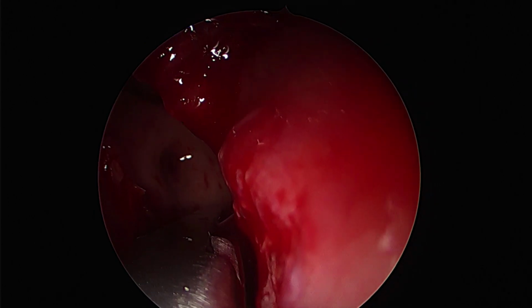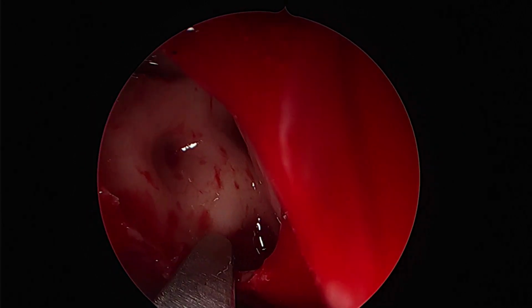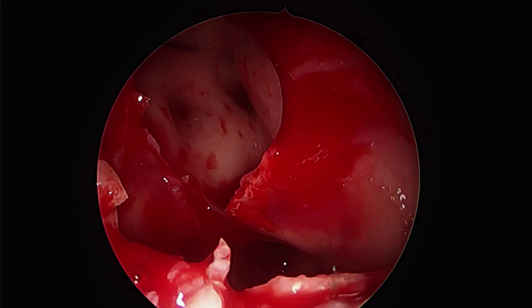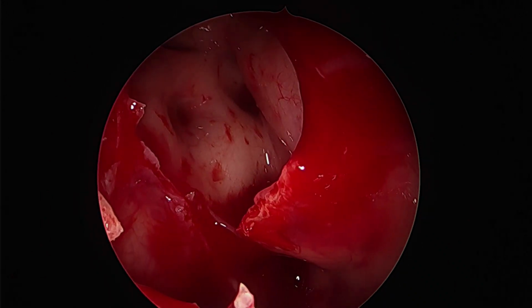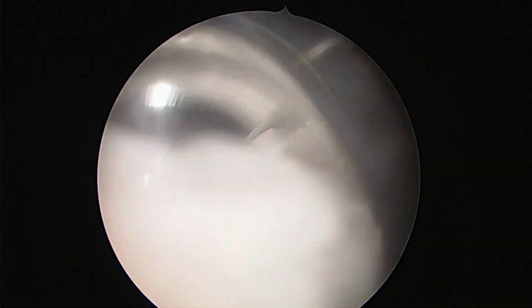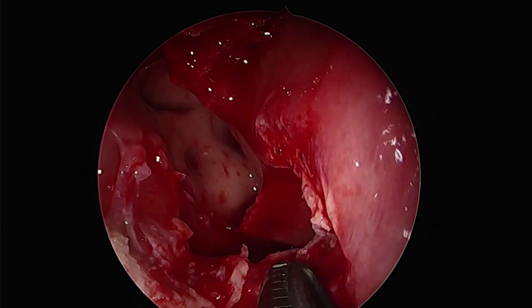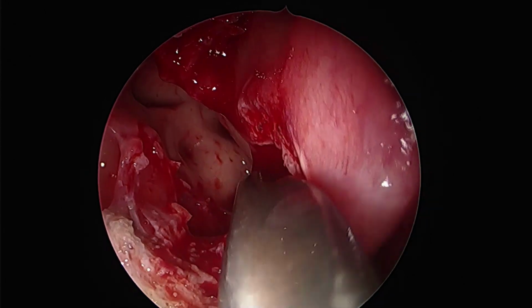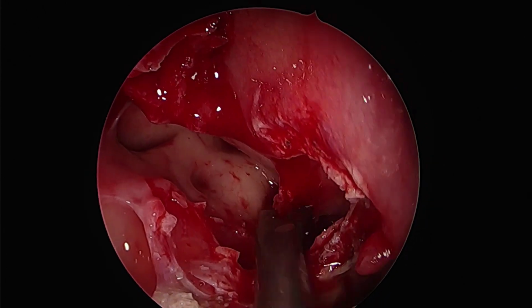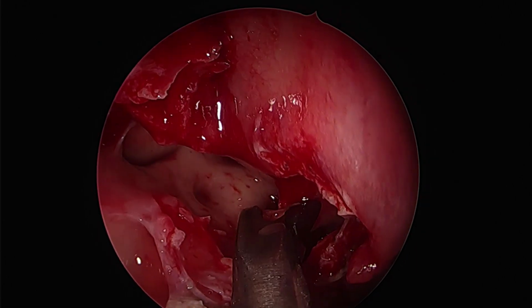Since most of these septations will attach to either the sella or the carotid, they are never to be avulsed. They can either be drilled or they can be cut through with good through cuts. In this case, cranial through cuts, which we reserve for these steps. Here we are using a slightly bent through cut in an upside down manner to remove some more septations medially.